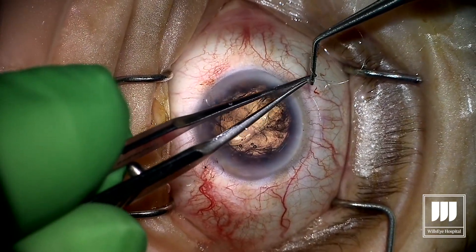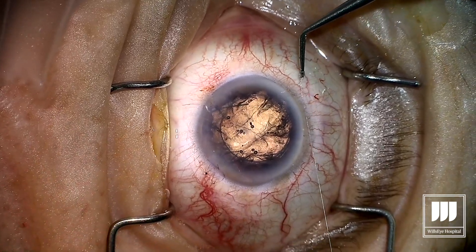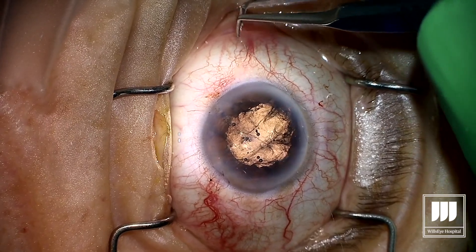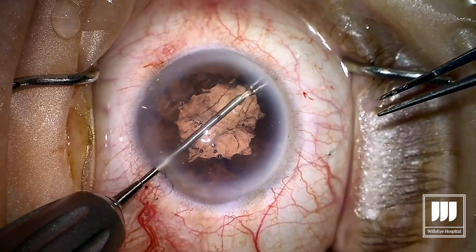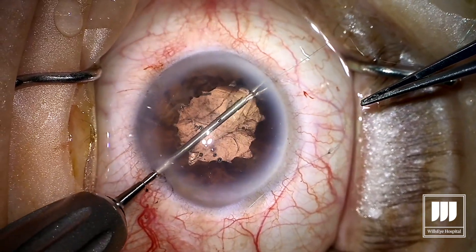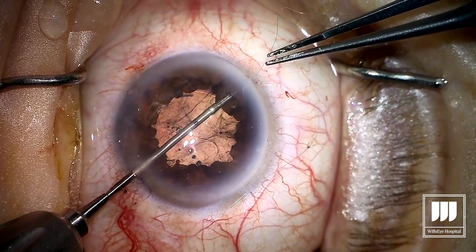At the completion of the surclose suture, we're going to make a 3-1-1 knot, and this is the part that's similar to the McCannell. We're tying both ends through a single paracentesis — both ends of the suture are protruding through a single paracentesis. Now we're going to use an intraocular tyer to grab onto one end of that suture, pulling the knot, or the row of three, into the eye.